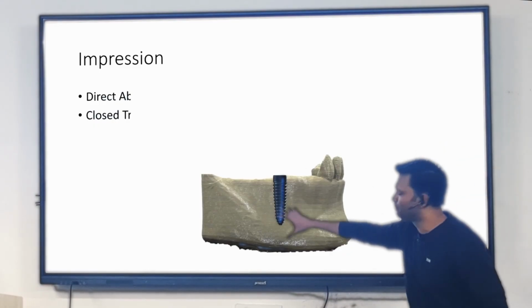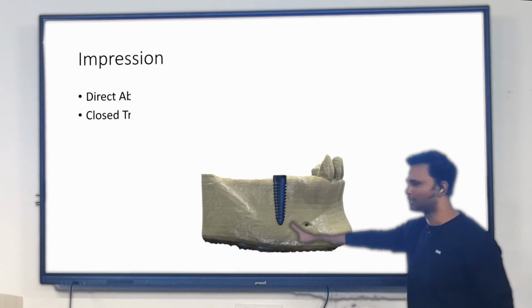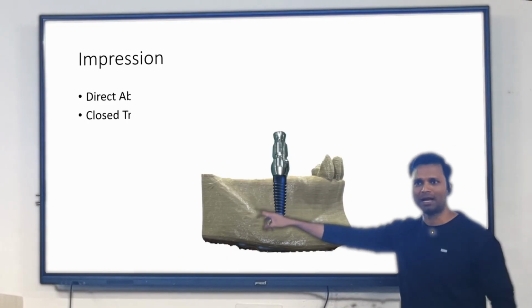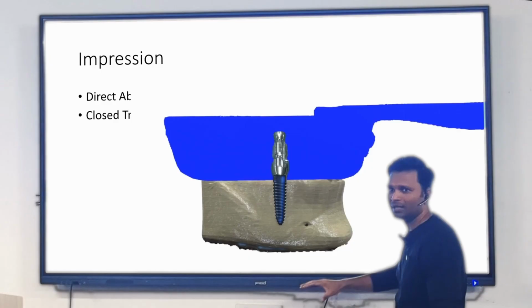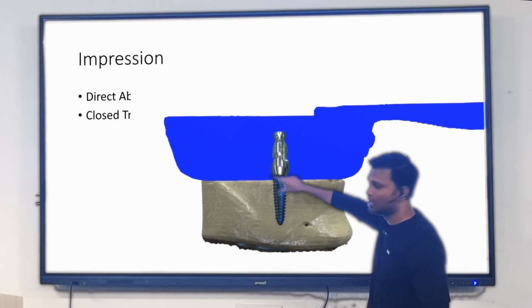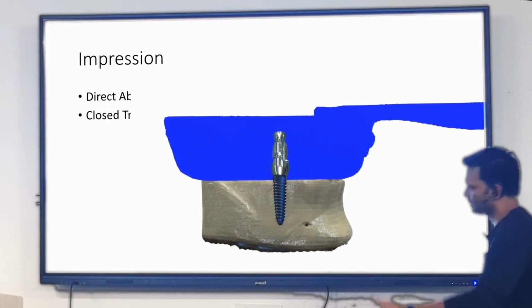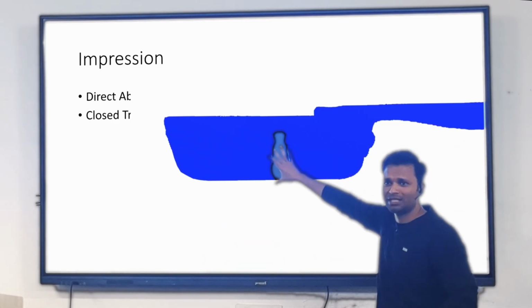Now, we place the implant inside the patient's mandible. This is just to show you guys there's an implant inside the body of the mandible. Next. We attach the closed tray impression post on top of the implant. Then we take an impression. This is the impression tray. This was tightened with the hex driver on top of this, right? When we take out the impression, this is going to create an indentation inside the impression, right? So this impression post left an impression inside this.